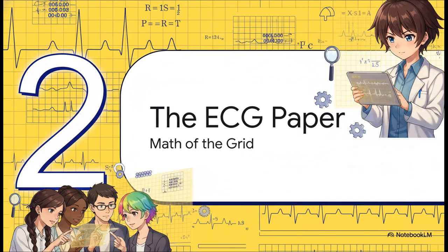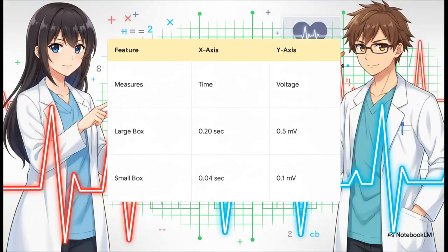Moving on to Section 2, understanding the ECG paper. You really can't calculate heart rates or spot any abnormalities without fundamentally understanding the math of the grid. Let's break down the design. On the grid, the horizontal x-axis strictly measures time in seconds, while the vertical y-axis measures electrical voltage or amplitude in millivolts.